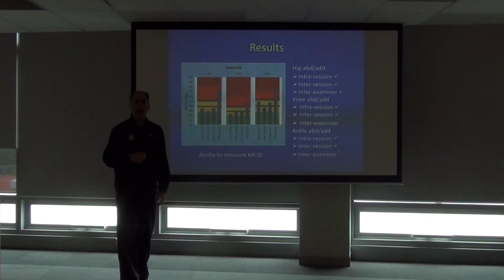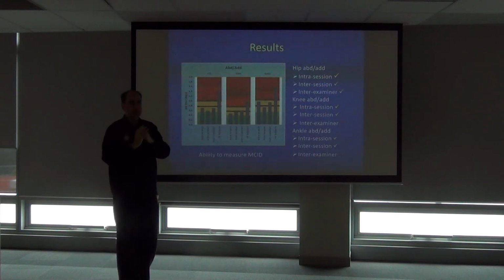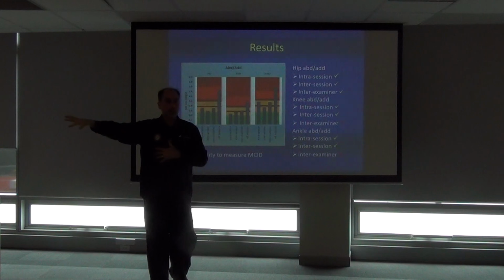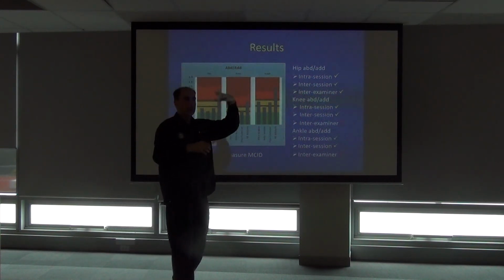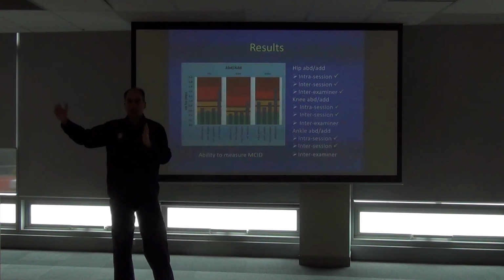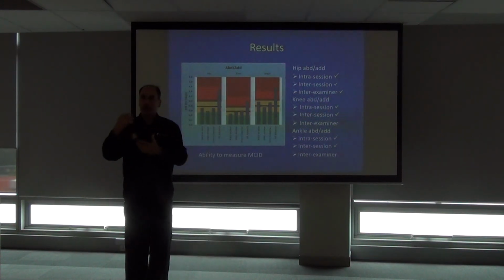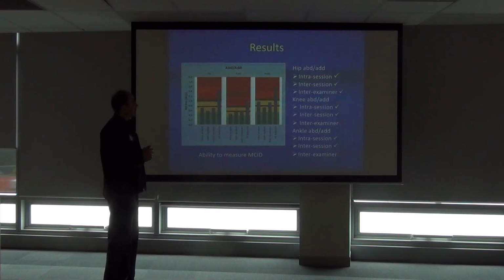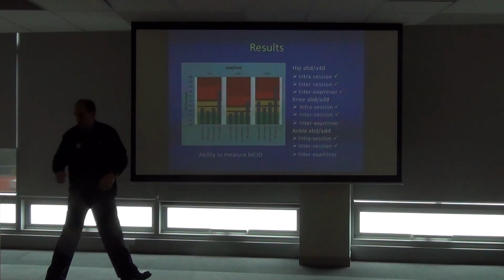As a check on the first, if that initial alignment of axes before you start trying to minimise and reduce differences to a standard or an expected value on your knee internal-external rotations. So maybe there's a need to look at that initial estimate, the goniometer, and to improve between examiner initial estimates, have 2 examiners there. One, as I said, to measure, one to check or verify, to help reduce some variability there. So there's some things there to look at in inter-examiner. So we'll keep going.